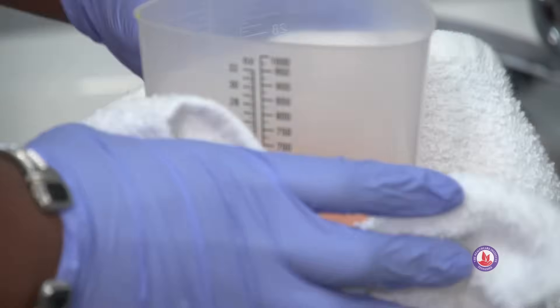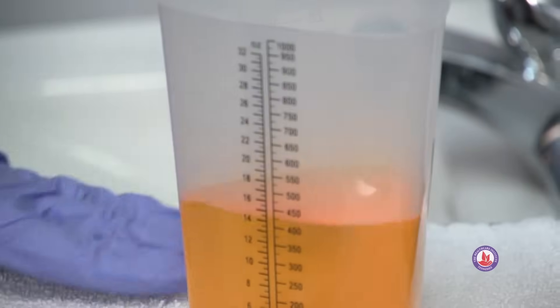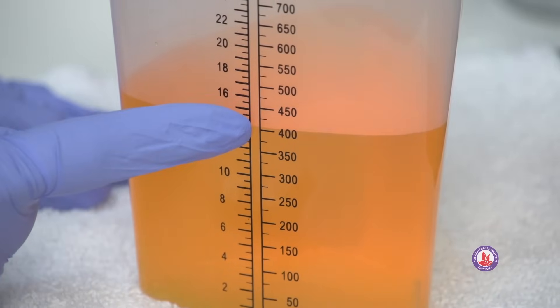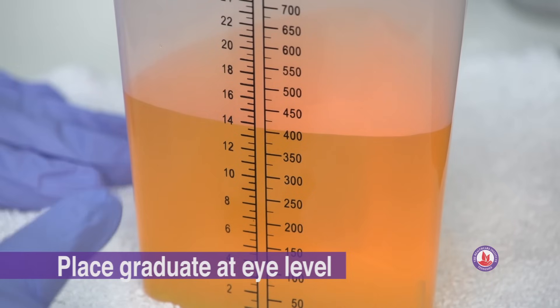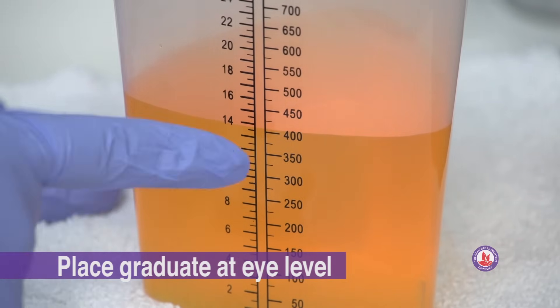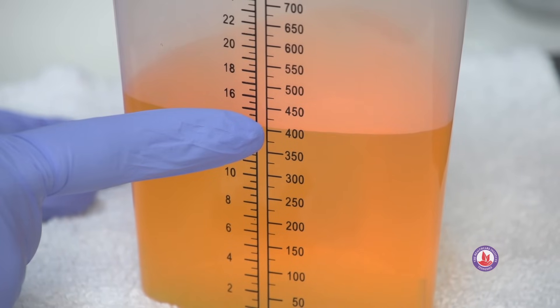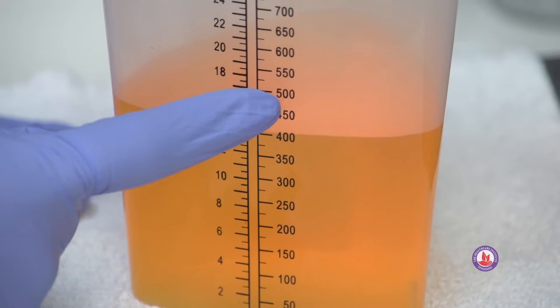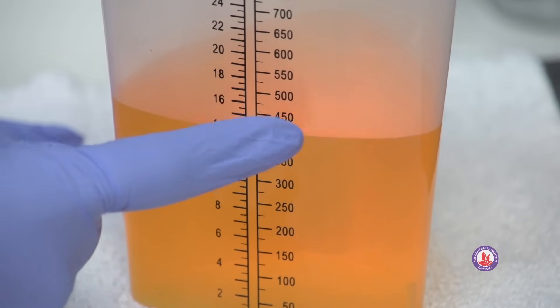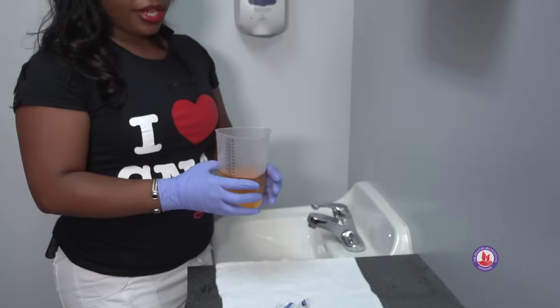Now we have to read our drainage from our catheter. We're going to read this at 400 cc's of output. We have to read it at eye level, so we get down to eye level to make sure we're at 400 cc's of output. The bold lines are either going to be 100's or 50's — so we've got 400 here, 450 here. The small lines are increments of 25.